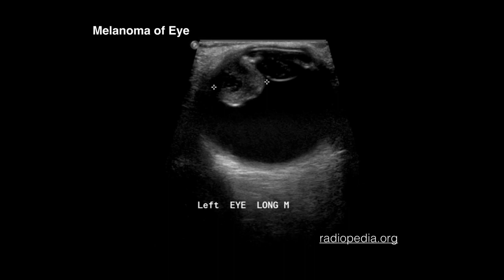This isn't a foreign body, but it's a sign. So I want to show you something else that you might be able to see in the eye. This is a melanoma of the eye. So just be aware of that. Other things might be picked up on. So clearly, if you saw this, someone coming in with vision changes, it's not for you to diagnose what this is, but clearly it can help speed along the patient's workup and process and get the right team and patient hooked up with the right specialist.